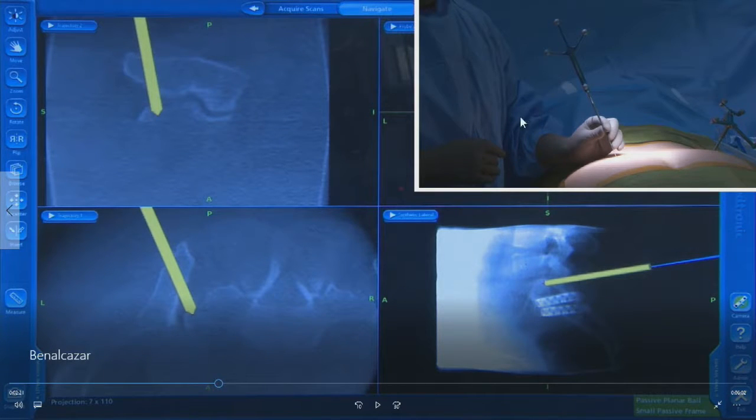The other thing to look at is in the upper right corner — the live video showing the general location of the Rialto implant and its trajectory. If you take a look at it, we are in a trajectory that's very familiar to all spine surgeons: the placement of an L5 pedicle screw.